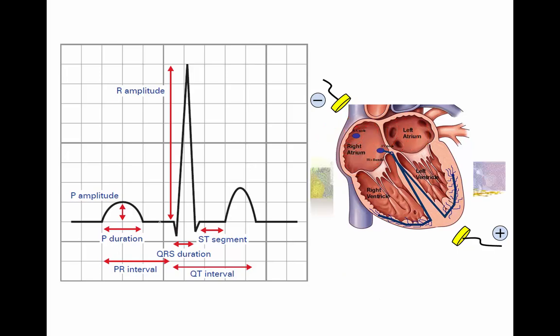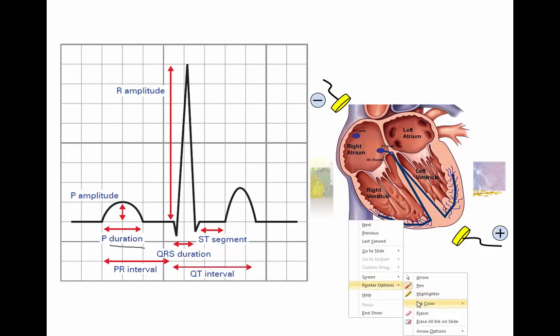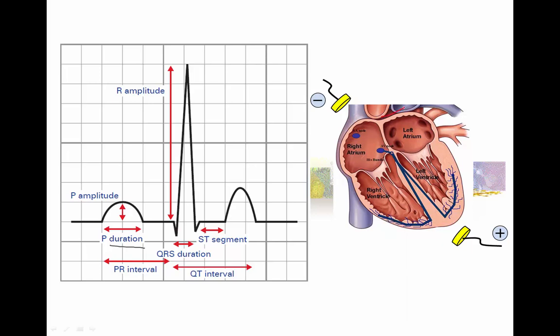On the other hand, when you have an increasing duration of the P wave, it's normally associated with the fact that the left side of the heart is enlarged, so you have a dilation or hypertrophy of the left side of the heart, and then the depolarization goes cell by cell, but takes longer to reach all the way to the left side of the atria. And because it goes cell by cell, it tends to delay the depolarization as a whole. So you might see a wider P wave, or sometimes, as you see in another example, you might see a notched P wave because it represents the depolarization of the right atrium first and the left atrium second, overlapped.